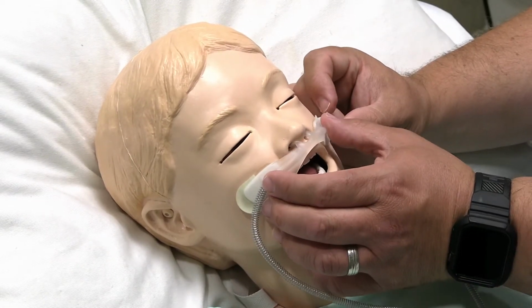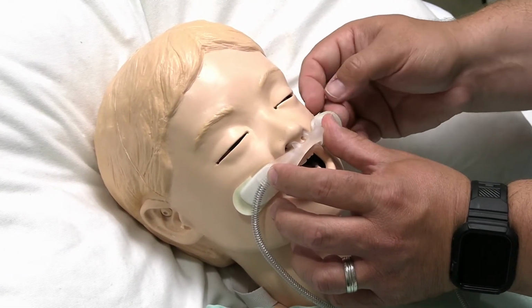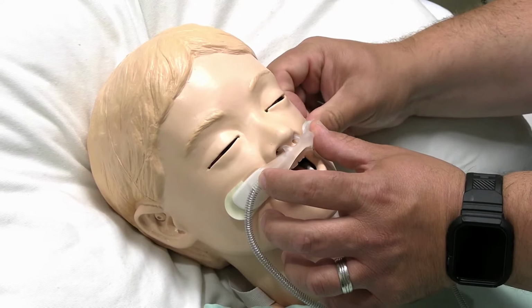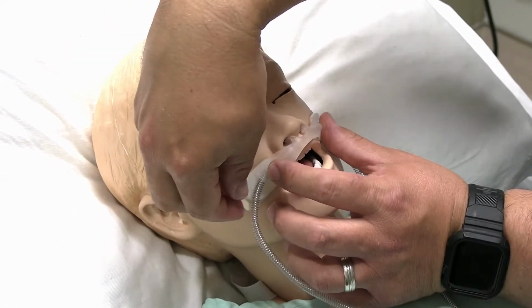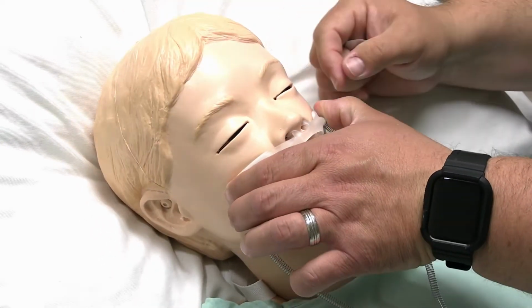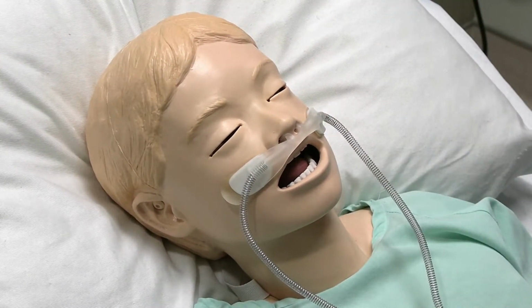You're then going to, for the first little part of the wiggle pad that you removed, hold that down with your hand just like so. You're then going to remove the second part of the backing off of the wiggle pads and just hold that down nicely onto the patient's face, just like so. Just pull that off neatly, just like that. And then just use your hands to hold them down. A little bit of the warmth will then allow that to adhere better to your patient.